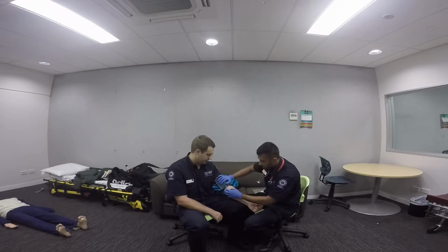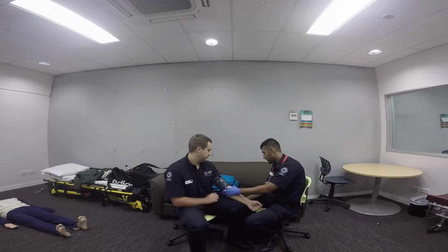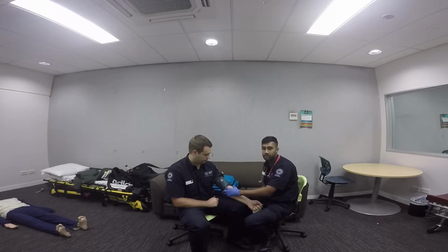Alright. After this I'm going to feel for Martin's brachial pulse. This is usually located towards the medial side of his arm, so I can feel that. Right, let's pop this here. Okay, so I'm going to inflate the blood pressure cuff until I can no longer feel Martin's brachial pulse, and this will give me a rough indication of Martin's systolic pressure.